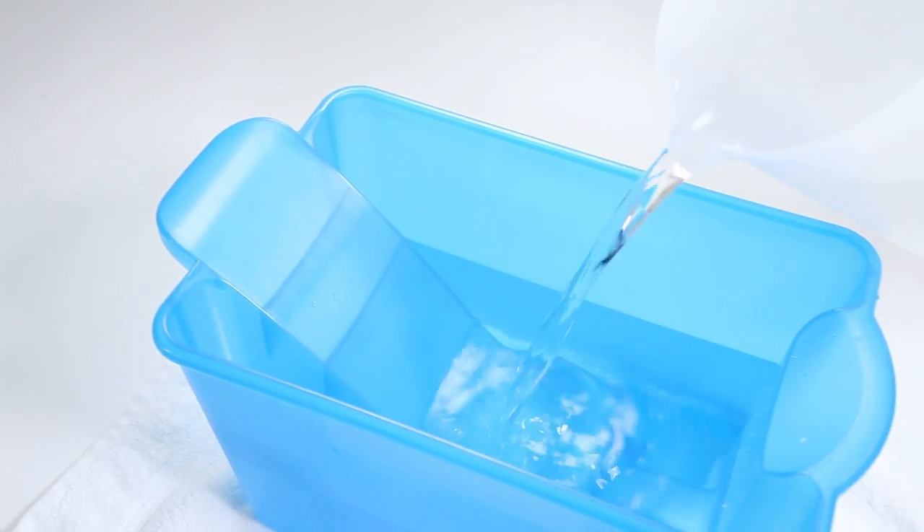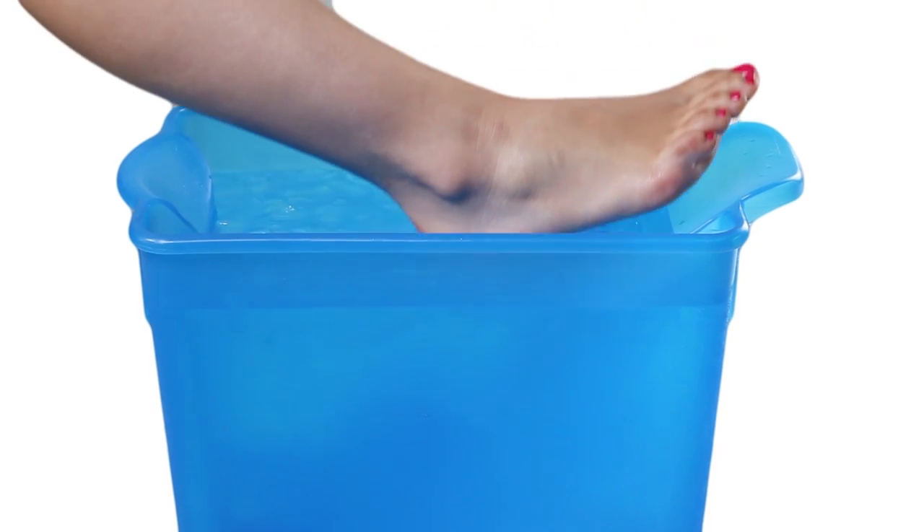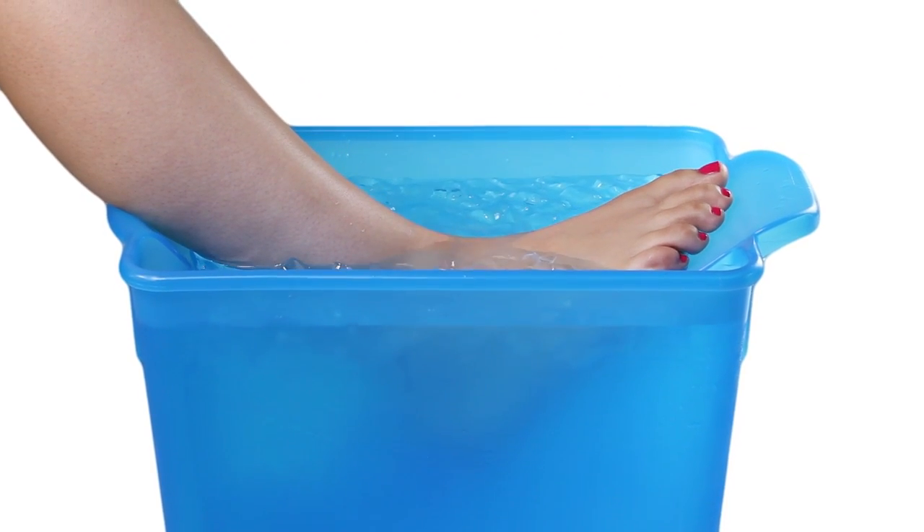The Ankle-Aid. The first water submersion device designed specifically for ankle and foot therapy. Yeah, that's nice.